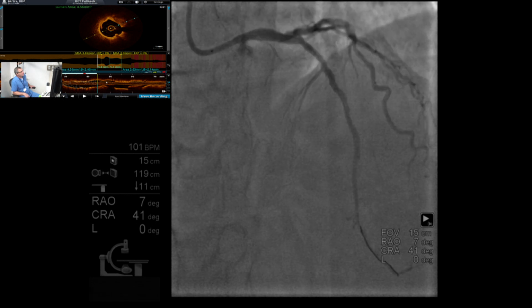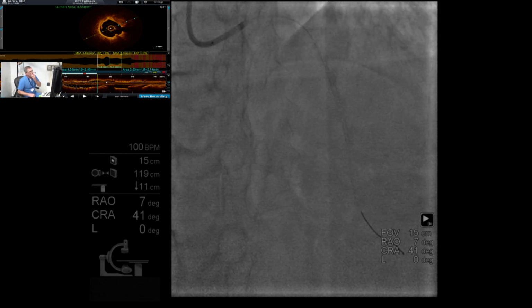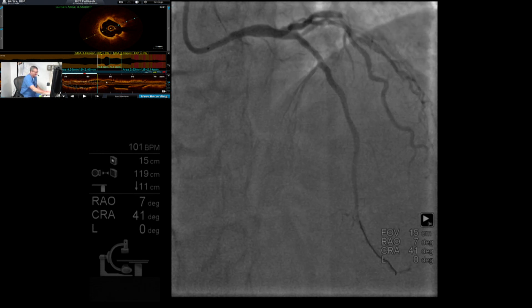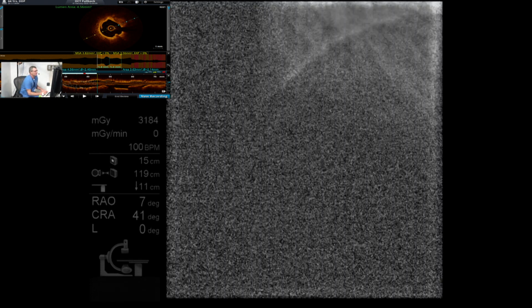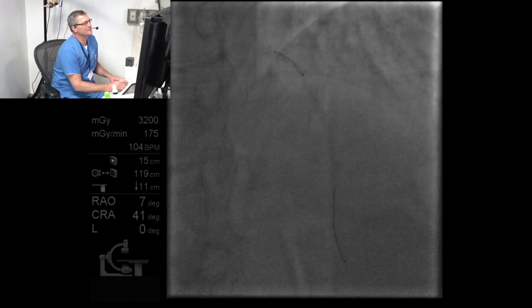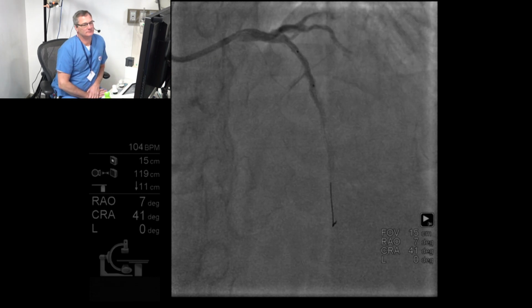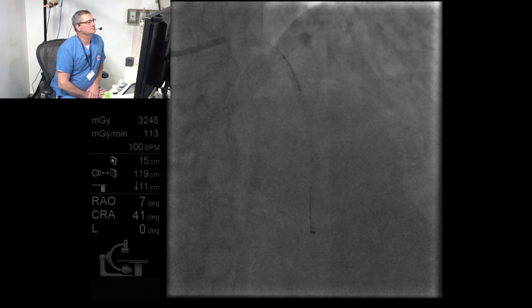See this angio. There is some little heaviness now, retrospectively you can see in the proximal part. Thank you. Ready? They are quite quick. Another thing is this Onyx balloon is more on the compliant side. It expands too much, so you have to be careful. But we have a good landing zone proximally, no problem.